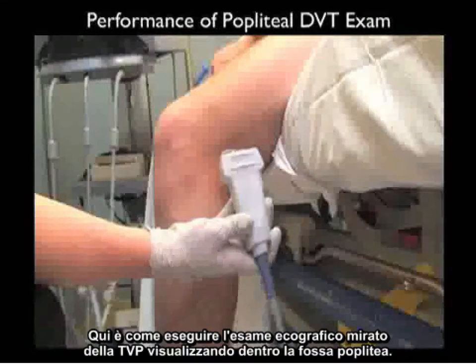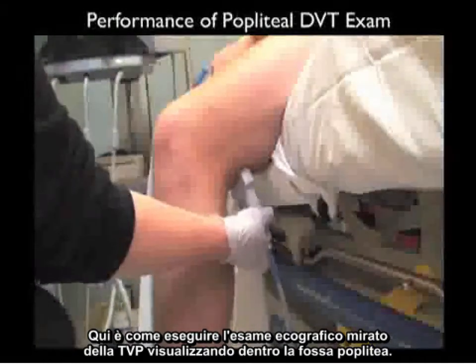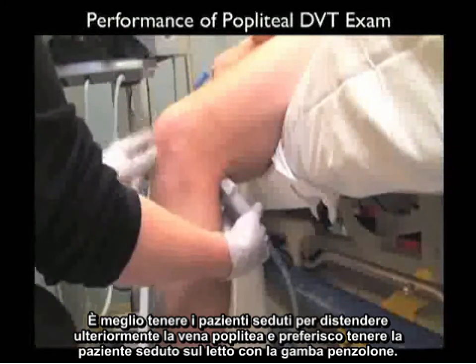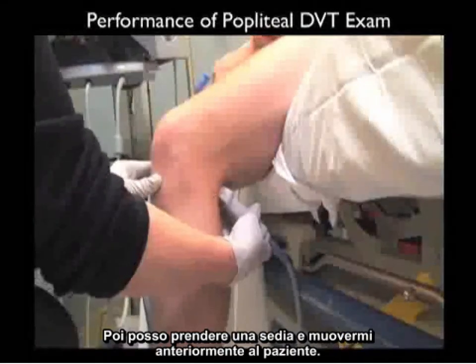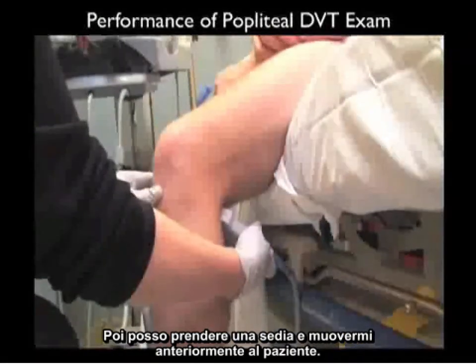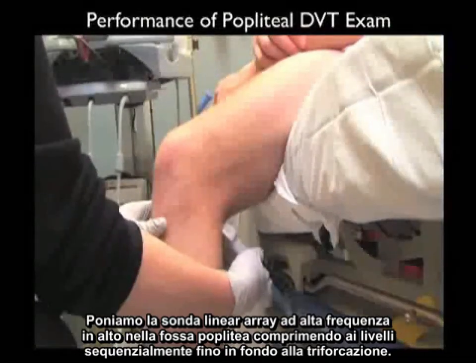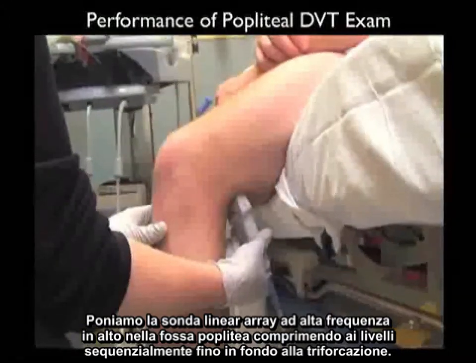Here's how to perform the focused DVT ultrasound exam looking into the popliteal fossa. It's best to have the patient sitting up to further distend the popliteal vein — I like to have the patient sitting up with the leg dangling over the bed. I can then pull up a chair and move anterior to the patient. We'll place the high frequency linear array probe high within the popliteal fossa, sequentially compressing at levels down all the way to trifurcation.